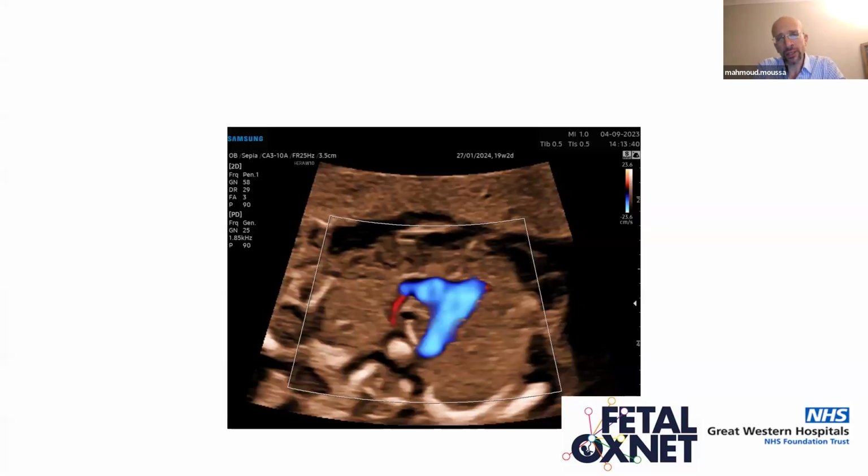Also, what do you think about this one? You can see a vessel just behind the trachea, which is going to the superior vena cava. Sometimes we get referrals of these views as an apparent right subclavian, but this is not the subclavian. This is the azygos draining into the superior vena cava, which, if you have a good machine and a slim patient, you can see in the 3-vessel trachea view. So that is a completely normal variant.